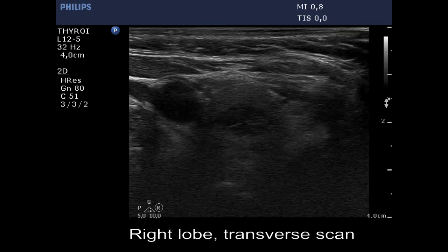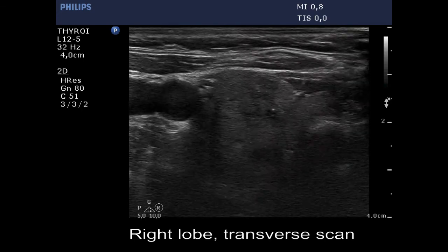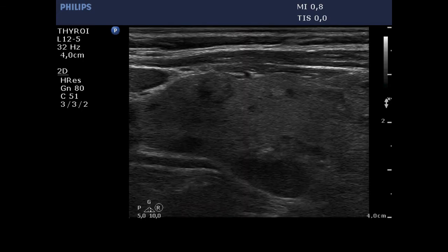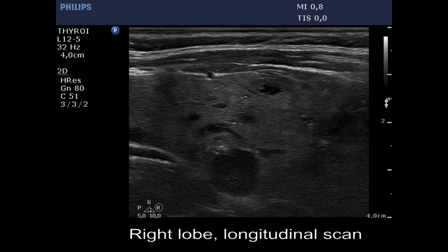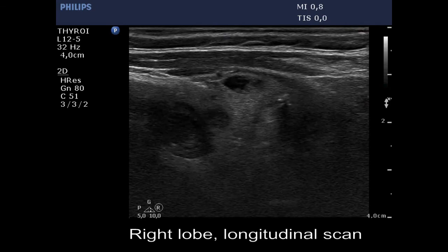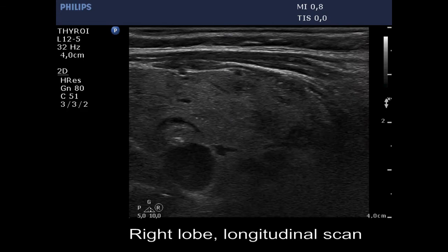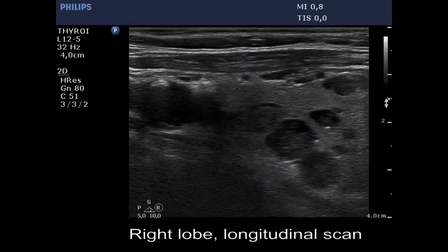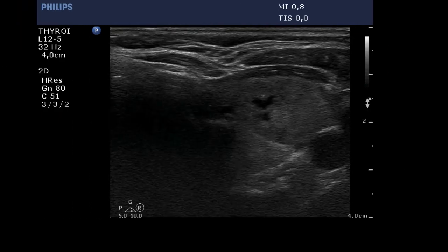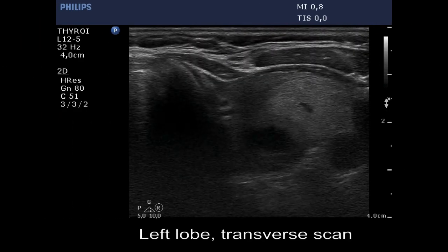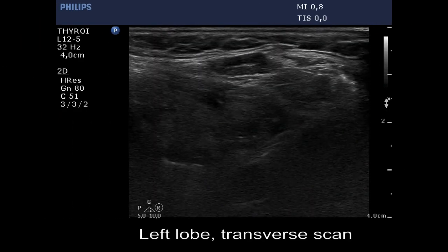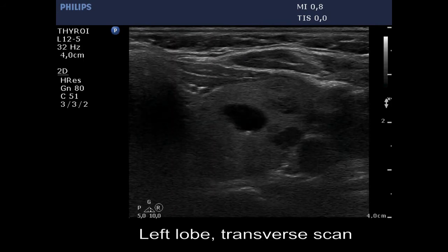The right lobe is echinormal and has several more or less hypoechoic discrete lesions. Most of them are cystic and present hyperechoic granules, caused by back wall posterior enhancement. The left lobe has a similar pattern; it also contains multiple discrete lesions of different echogenicities.